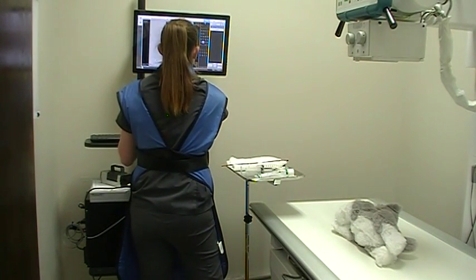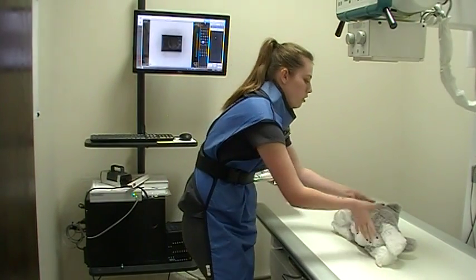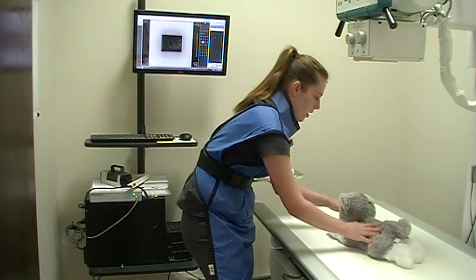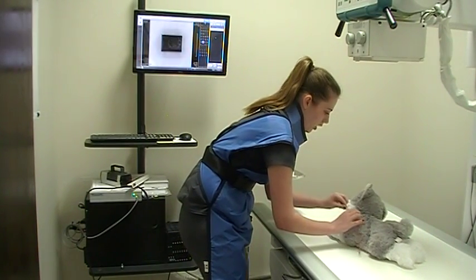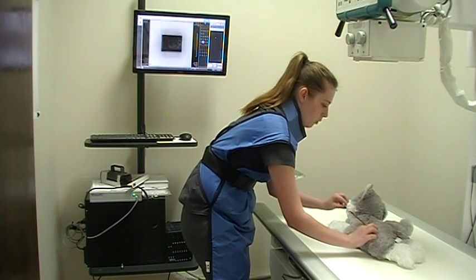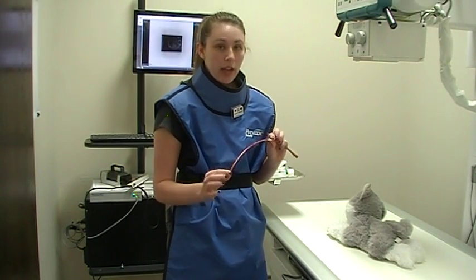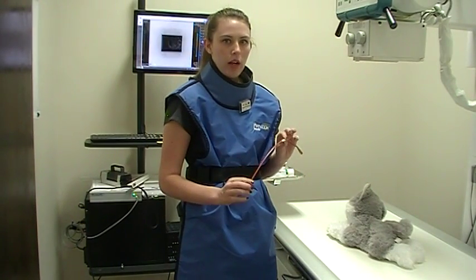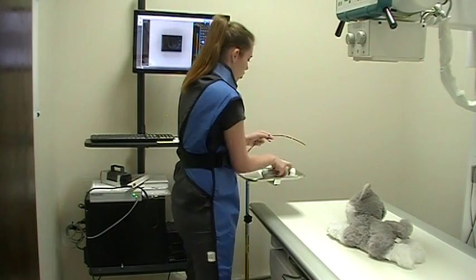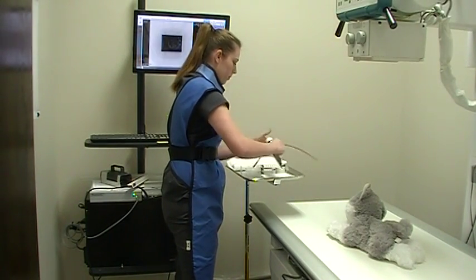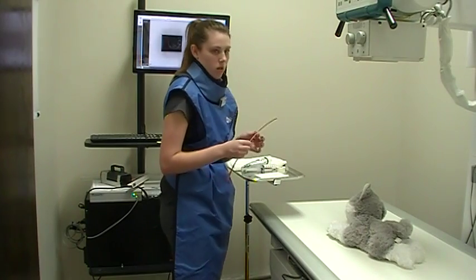I am going to make sure this is set back to our lateral, because we are going to be taking another lateral view immediately after the barium is administered. The first thing I want to do is sit my patient up in a nice sternal recumbency. I am going to take my gastric tubing and measure from the end of the snout all the way to the last rib, which should be where the stomach is. The reason we measure is because if we go too far we can actually perforate the gastric wall. Once that is done, we are going to take our lubricant and put it on a paper towel.